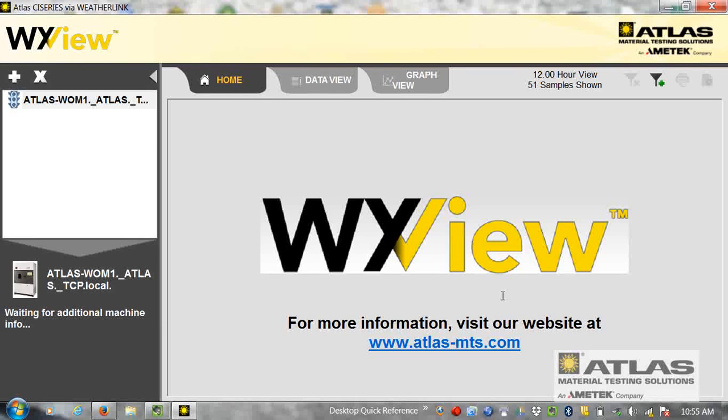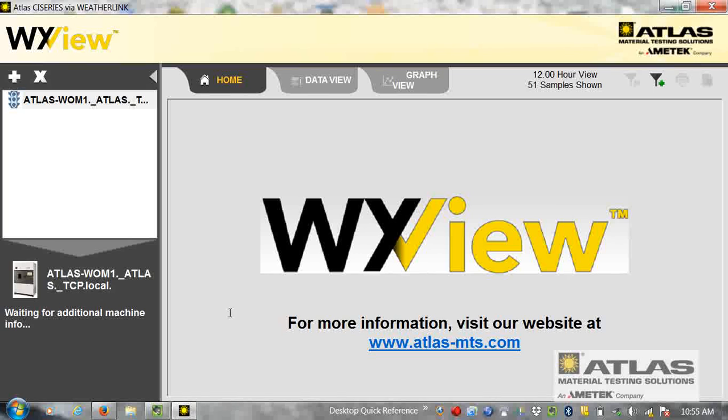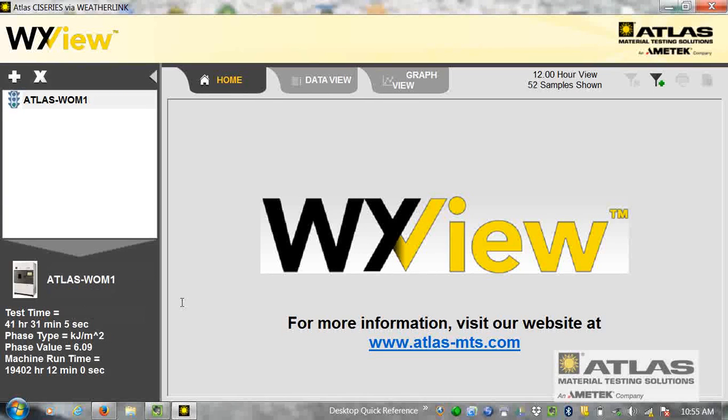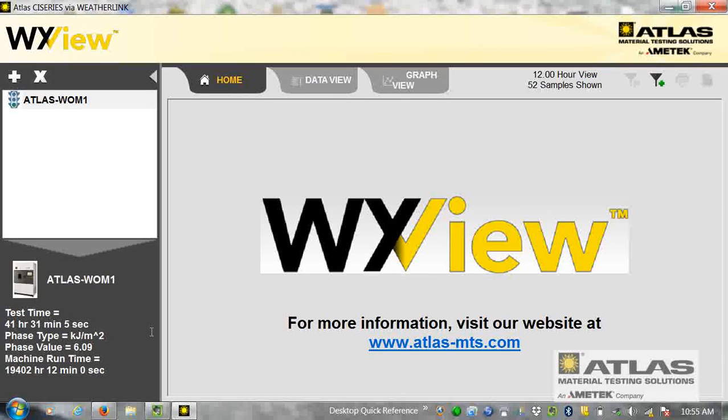There's the name. Click it, and eventually over in this area here, it will come up with machine information and test information.